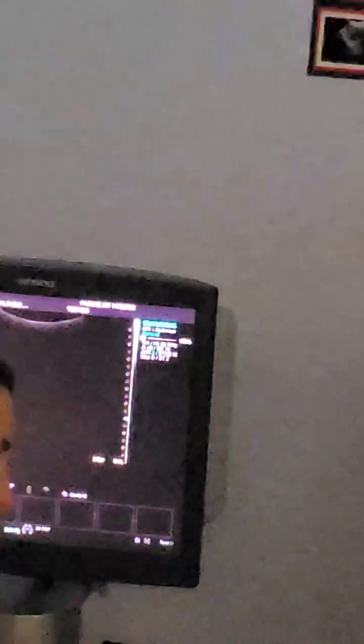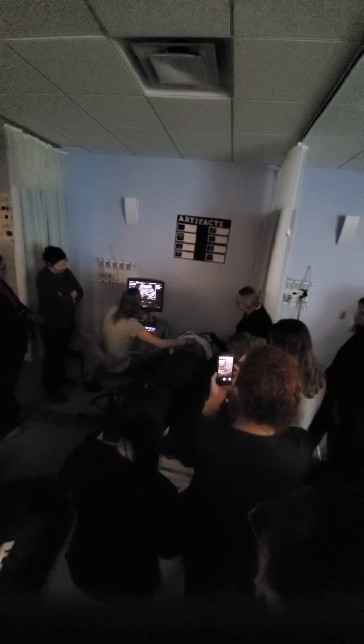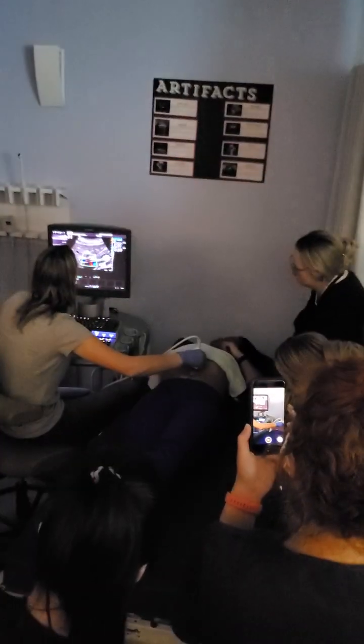Okay, so you want me to go over that one again because that was pretty quick. So we went down, kind of in our dome land, cruising down. We went to hepatic land, coming into portal land. There's that main portal vein crossing the IVC. We kind of lengthened that guy out. We threw a color box on to prove what we were looking at.